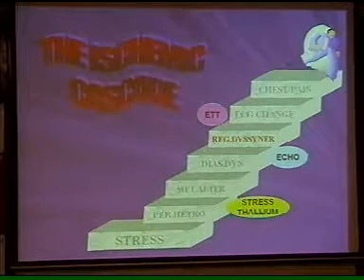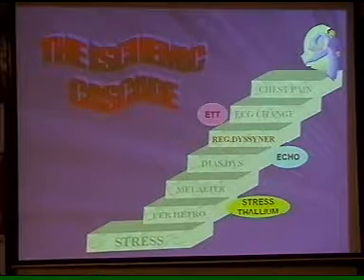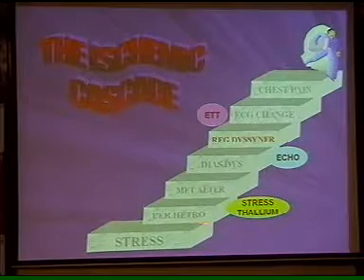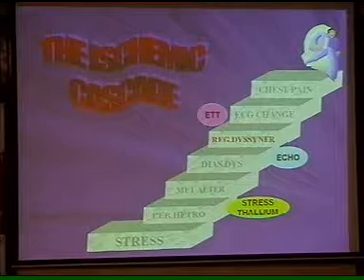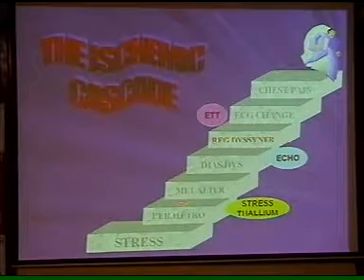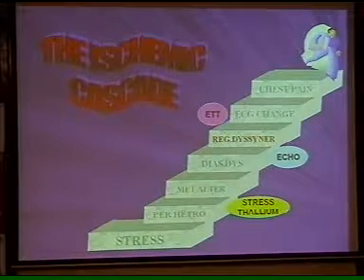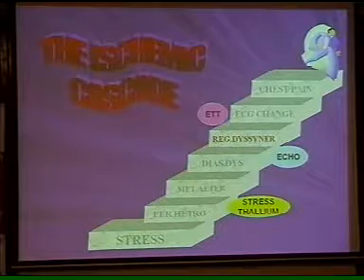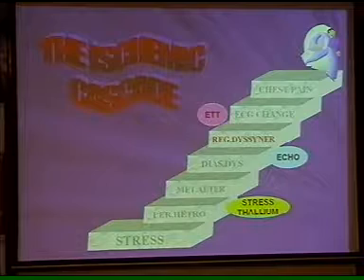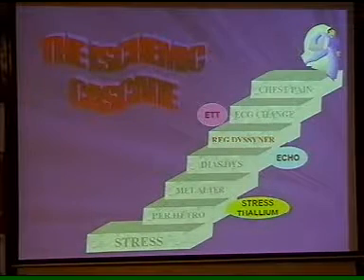And the third thing is stress thallium. It is not a test to do in the clinic or in the emergency. Obviously it's a planned test, but as compared to routine echo or echo at rest, it has good sensitivity to pick things up quite early. So sometimes it can overestimate things. It may pick up simply pathological or aging phenomena rather than a clinical scenario. So you have to keep this in mind before interpretation.